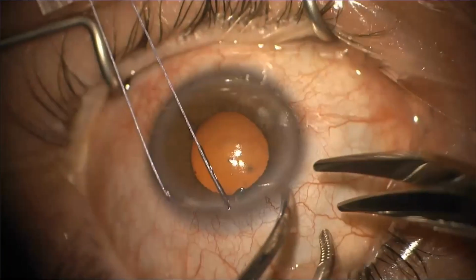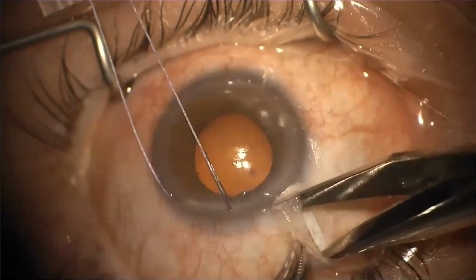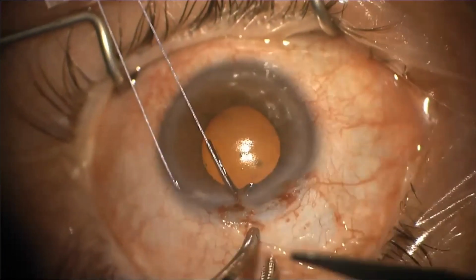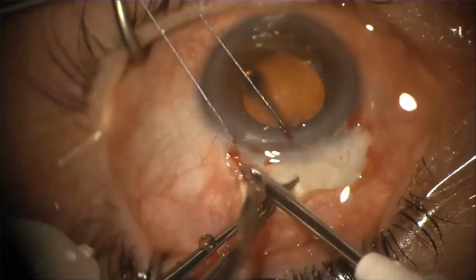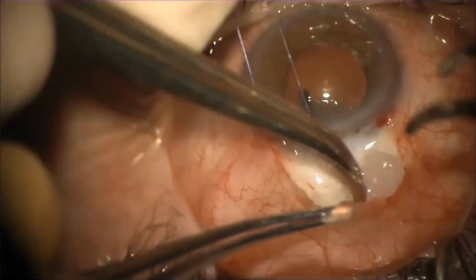So let's see. This was my first microshunt implantation. You'll see here, I'm going to make a pretty wide conjunctival peritomy. I do like a traction stitch placed for most of my surgeries, though maybe not totally necessary here. Again, good posterior dissection, making a nice pocket. Here's our cautery. I'm going to apply the mitomycin next, being careful to protect the leading edge of my conjunctiva.